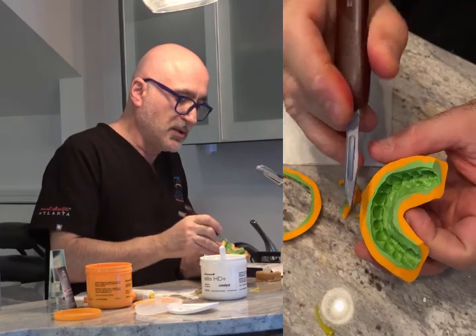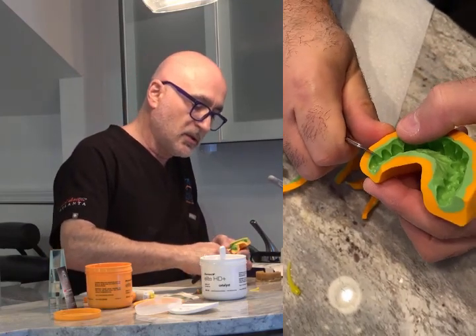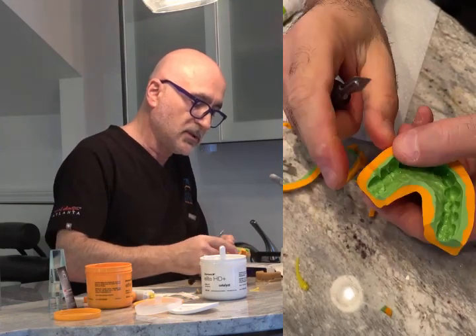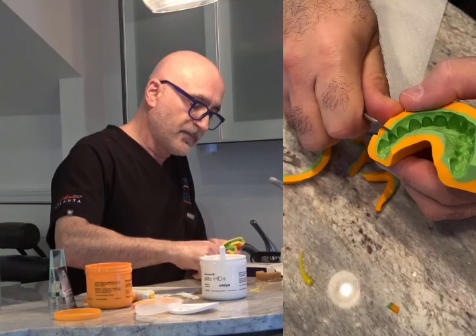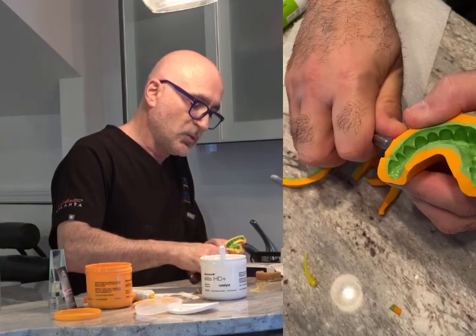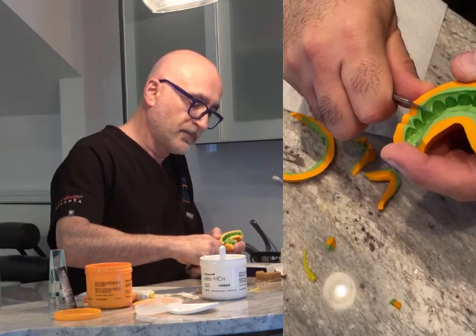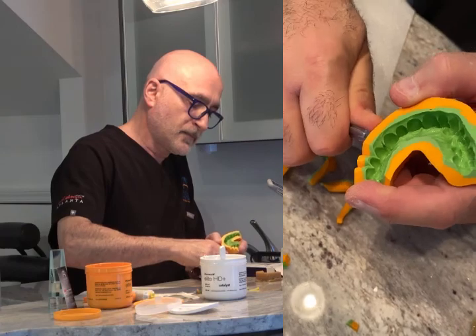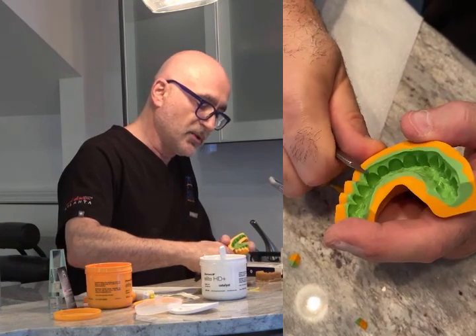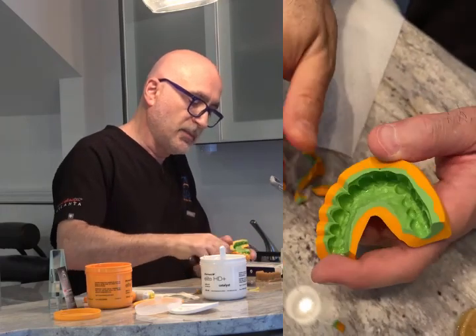Now I'm going to cut and sculpt each tooth individually in the papilla area. So when the Luxatemp or acrylic material flows out, you can cut off the proximal areas easily — just like that, with a little V cut. That's why it's crucial to have a very fresh knife, and long enough so you can see what you're doing. I keep enough excess just in case the doctor wants to cut more — he can do it himself. I get close enough. Some doctors like it closer, some don't. I like it a little bit longer like that.